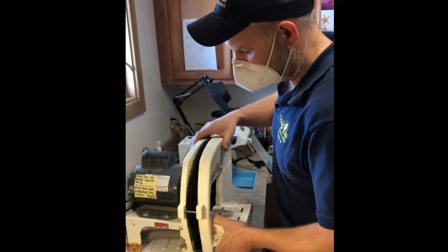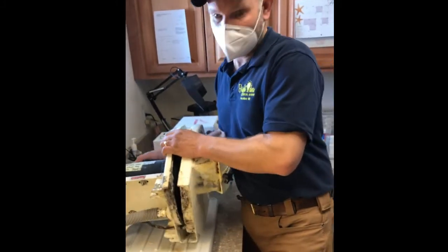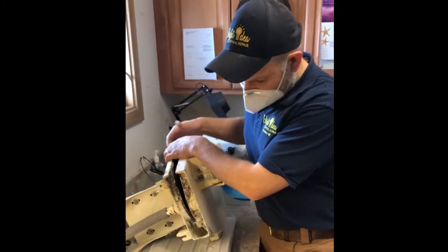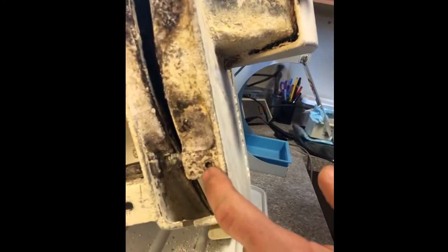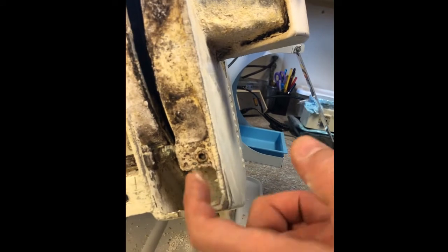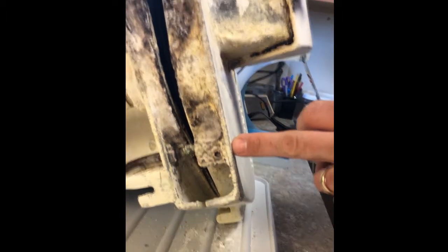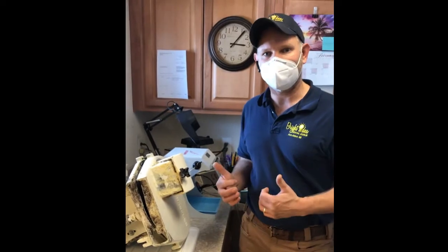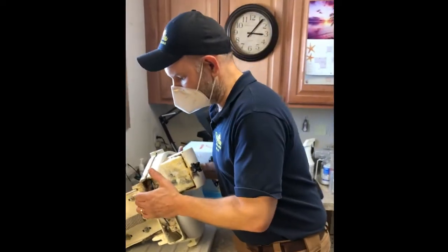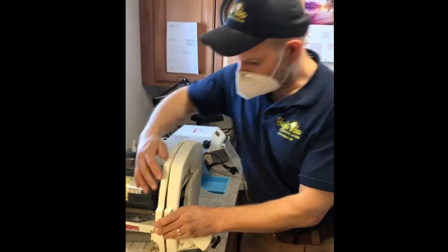So what we've already done is we've taken the unit and put it on its side like this, and we've already attempted to apply an Allen wrench here to try to undo this screw, which will give us access to clean out the port. Now that's not going to work. So what we've got to do is a little bit of a different technique that's going to involve going from the other side. I'll just walk you through it right now, and then we'll show you on video how we're going to do that.